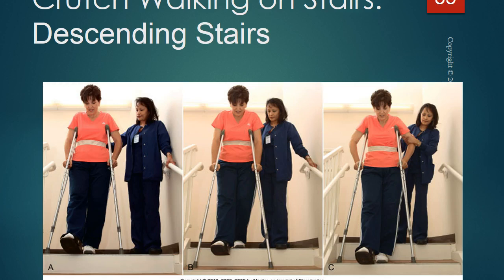Because in most cases patients need to use crutches for some time, they need to be taught to use them on stairs before discharge. This instruction applies to all patients who are dependent on crutches, not only those who have stairs in their home. You will frequently have to collaborate with the physical therapy team to ensure that instructions are provided about crutch walking.